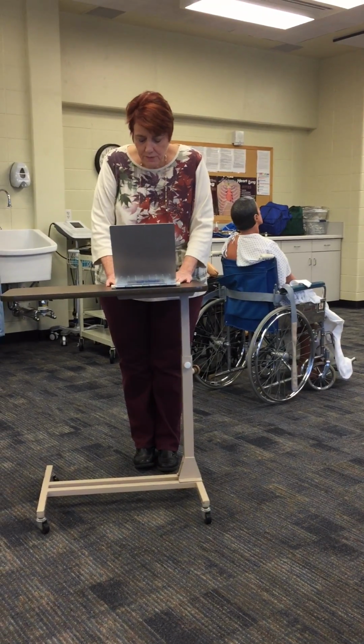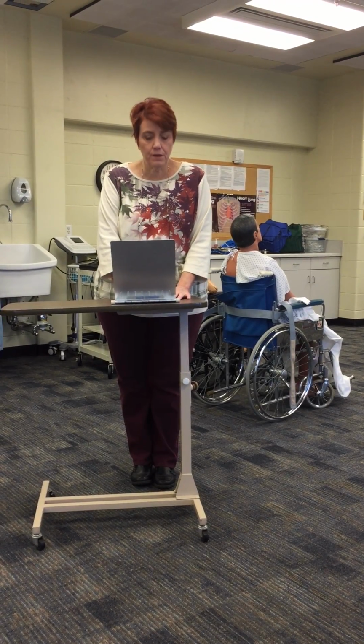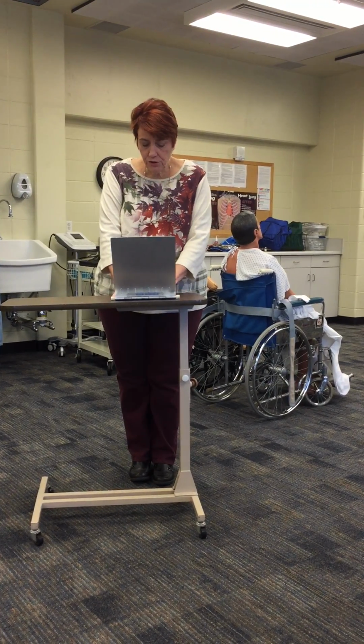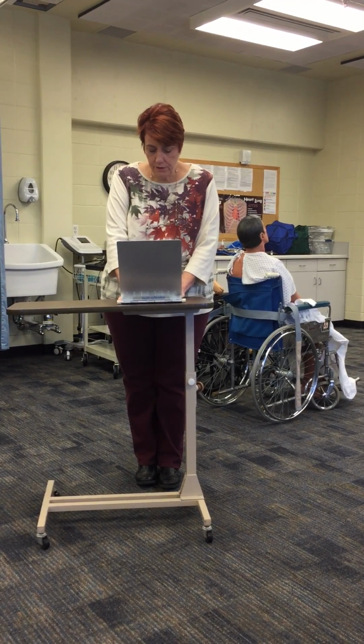Checking my patient's chart. It's Mrs. Livingston's chart for new orders, and I see here that I need to put a Foley catheter in because the doctor that did her surgery wants accurate I&O kept on her. I'm also looking at my patient's chart to make sure she doesn't have latex allergies or any reason why she can't get this Foley catheter.